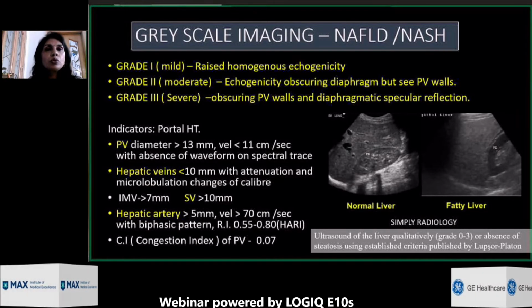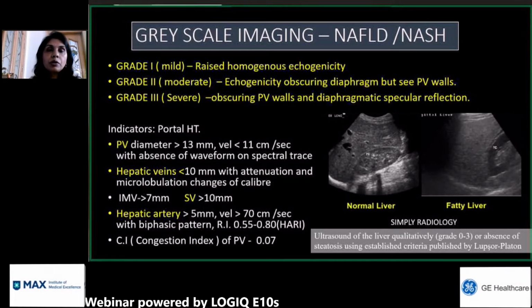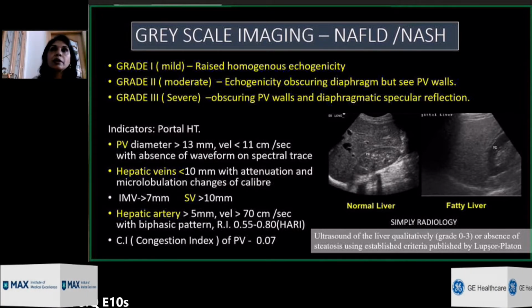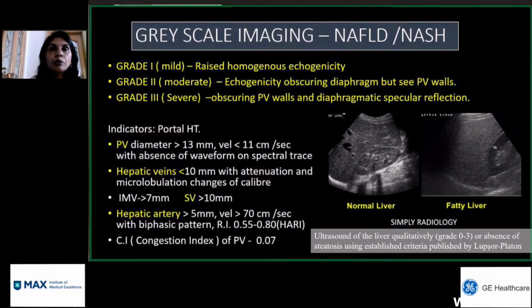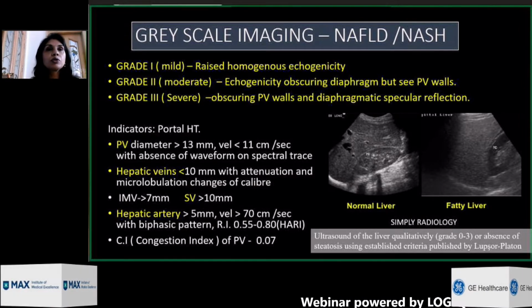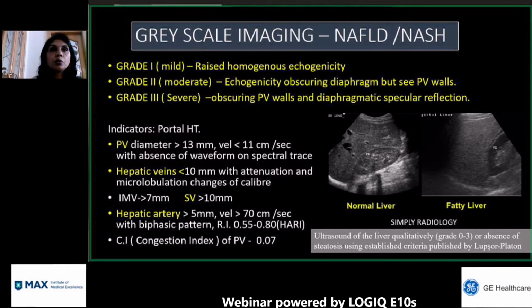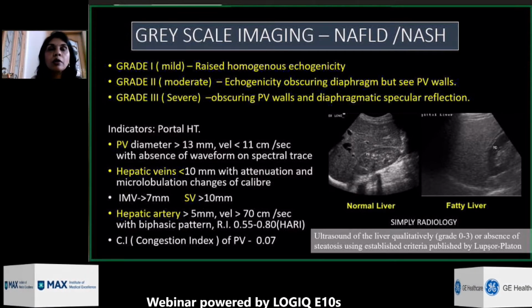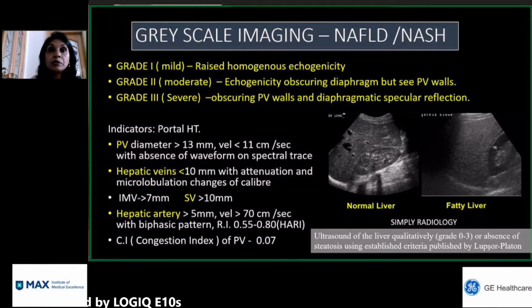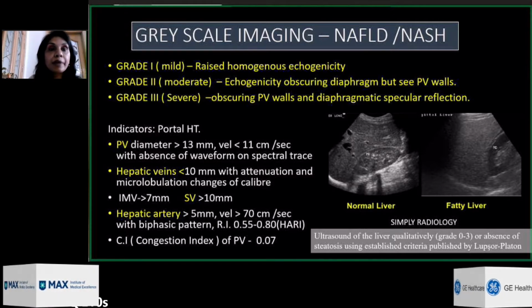We come to the ultrasound part of it. Ultrasound assessment of steatosis is the first part. Today, out of 100 patients that we are scanning, at least 90% go with fatty liver. And we are really not putting emphasis on how we qualify it; there is no quantification, which is, of course, the first step in the diagnosis of fatty liver disease.